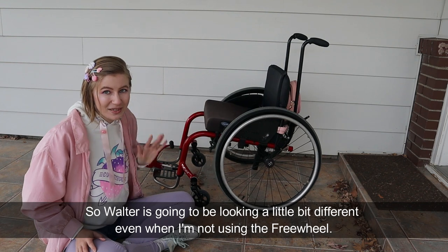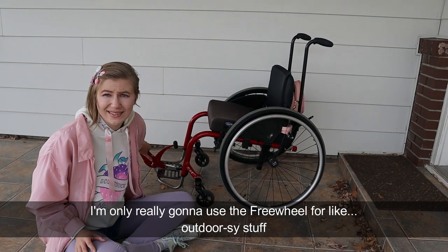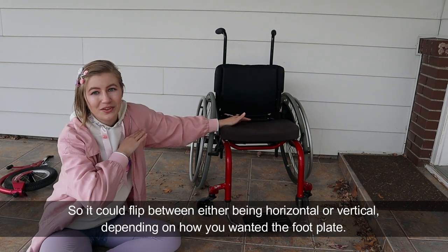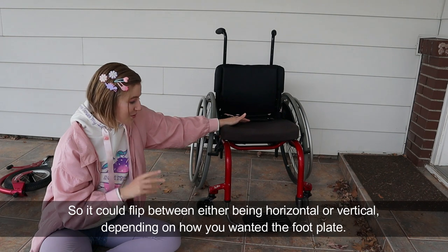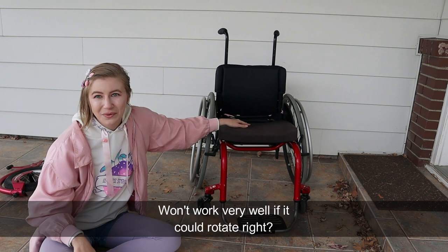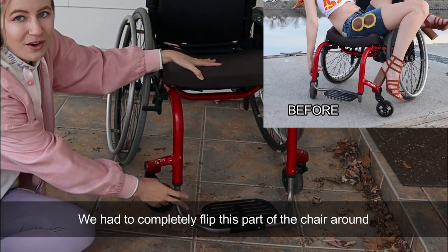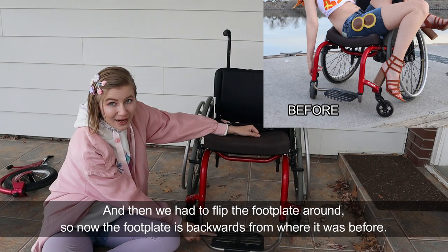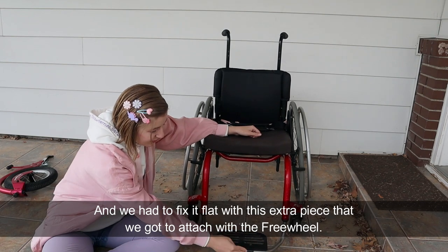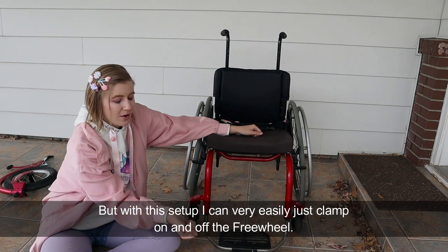Walter is going to be looking a little bit different even when I'm not using the freewheel. I'm only really going to use the freewheel for outdoorsy stuff. Before I had a flip-up footplate, so it could flip between either being horizontal or vertical, but that doesn't really work with the freewheel because the freewheel needs to clamp onto the footplate. We had to completely flip this part of the chair around, and then flip the footplate around, so now the footplate is backwards from where it was before, and we had to fix it flat with an extra piece that we got to attach with the freewheel. But with this setup, I can very easily just clamp on and off the freewheel.